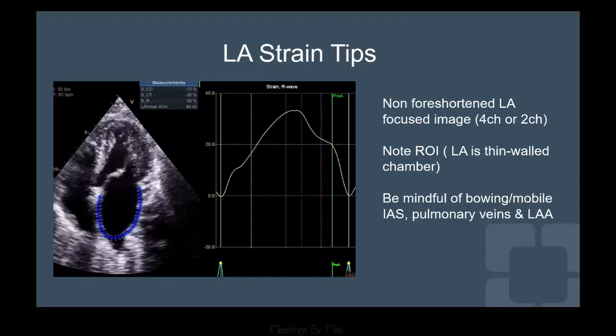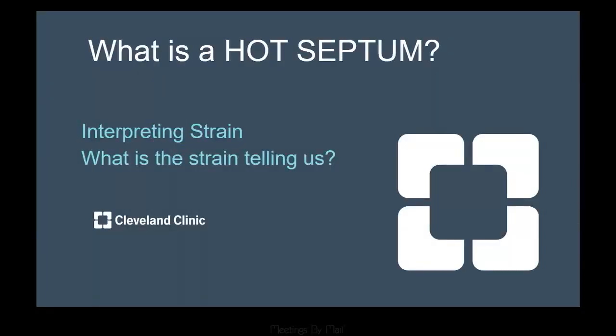Let's move along here. Okay, what's a hot septum? We're in sunny Florida. Is Dr. Klein getting a little heat stroke in his head? What is he talking about? Hot septum. Okay, next case.